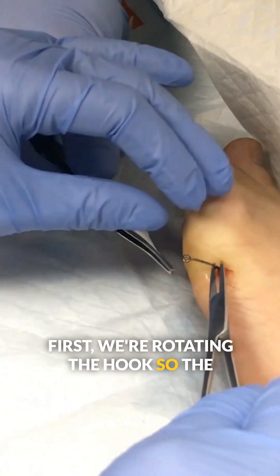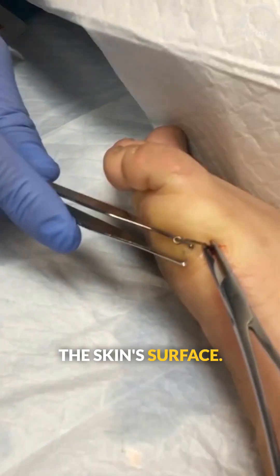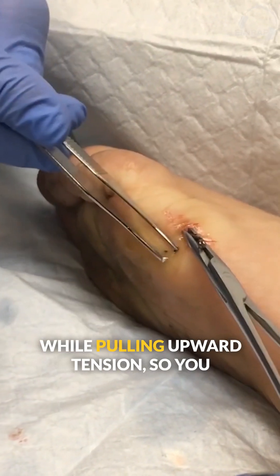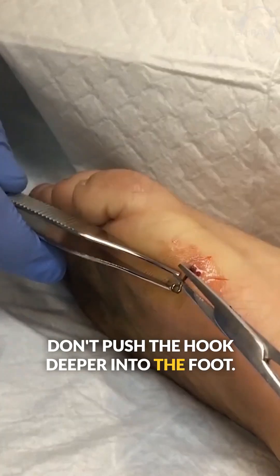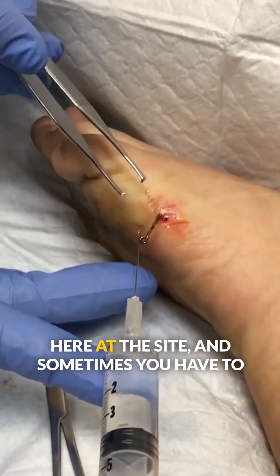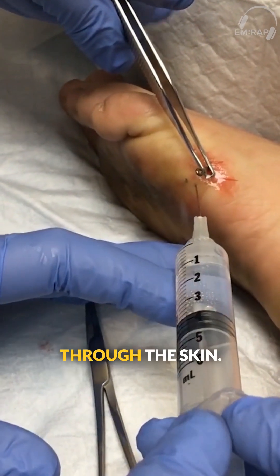First, we're rotating the hook so the tip is pointing upwards towards the skin's surface. Now you're going to push it through while pulling upward tension so you don't push the hook deeper into the foot. We're giving a little bit more pain medication here at the site, and sometimes you have to make a small incision here to get the barb through the skin.